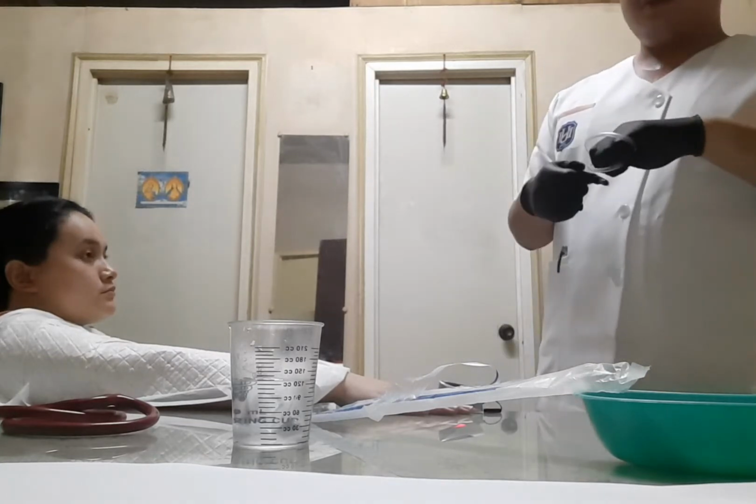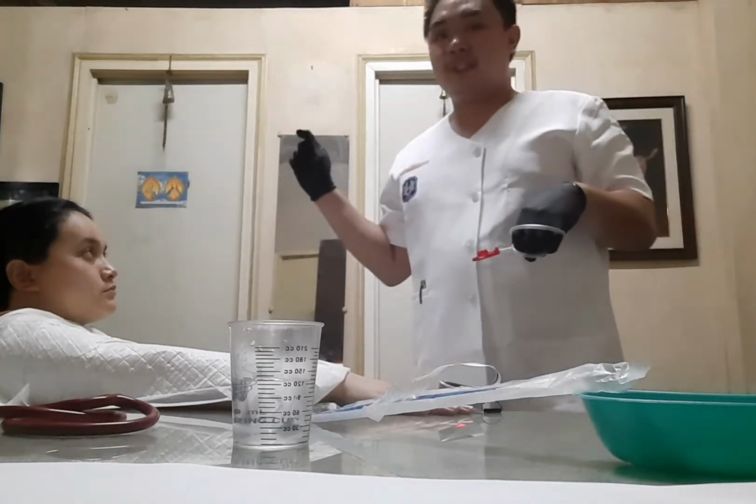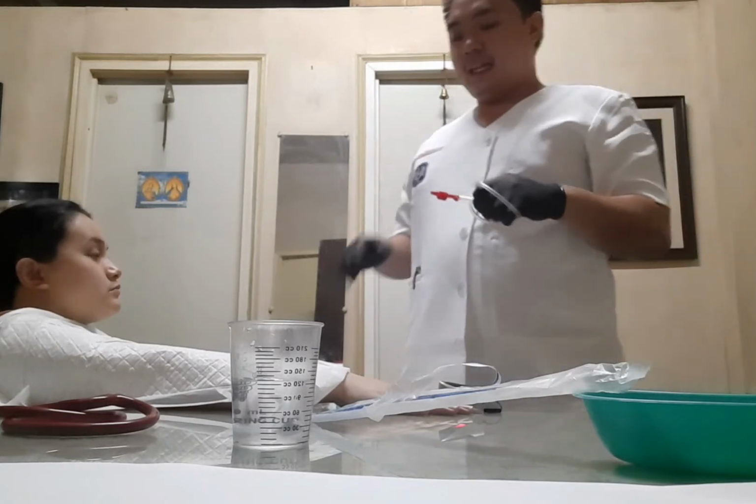While using the catheter, I will be assuming that I already turned on the suction machine and it is already set at 80 to 120 on the wall unit for adults.